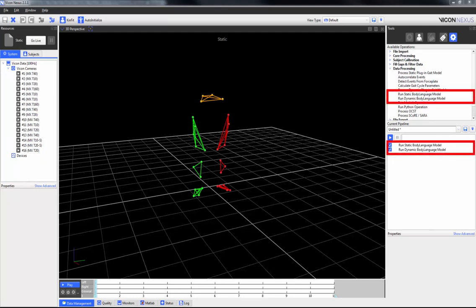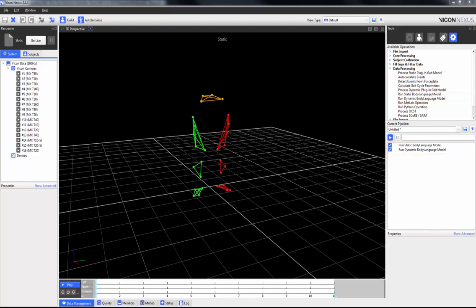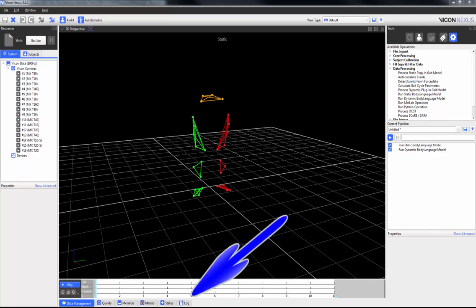The Run Static and Dynamic Body Language Models allow you to run static and dynamic BodyBuilder scripts, which in turn allows you to perform biomechanical modelling. The advantage of this pipeline operation is that it allows you to run scripts and therefore biomechanical modelling directly through Nexus and see the results in real time. If the script fails for any reason, you can debug by checking the communications log. I'm going to show you a simple script used in both the static and dynamic Body Language model pipelines.